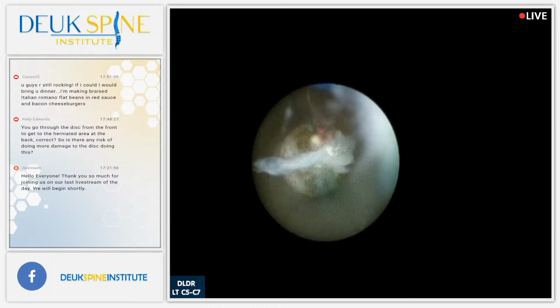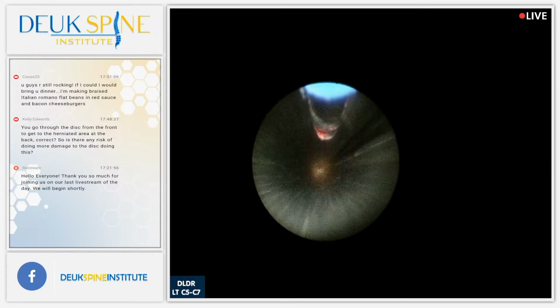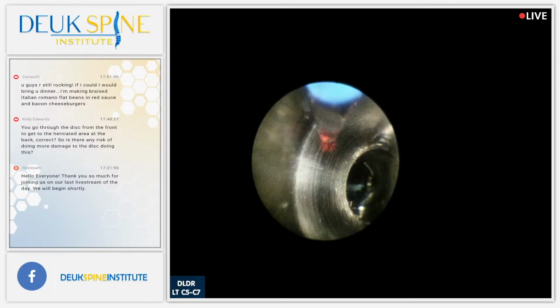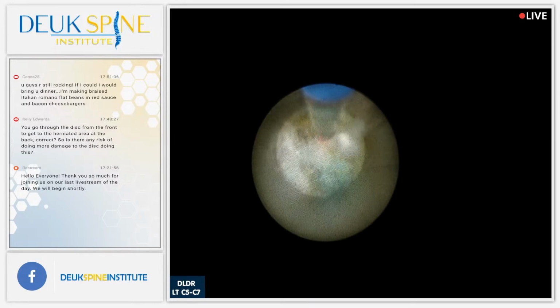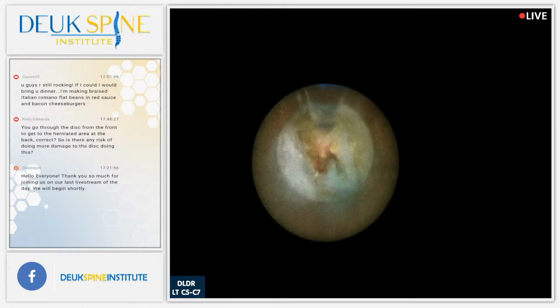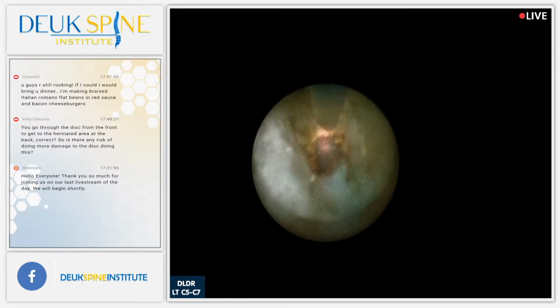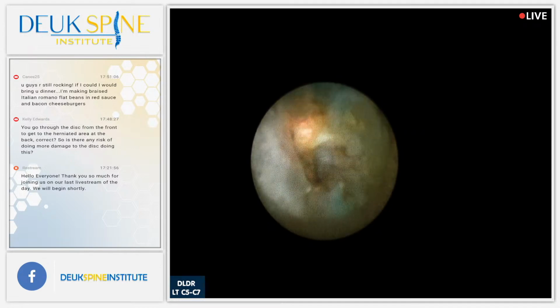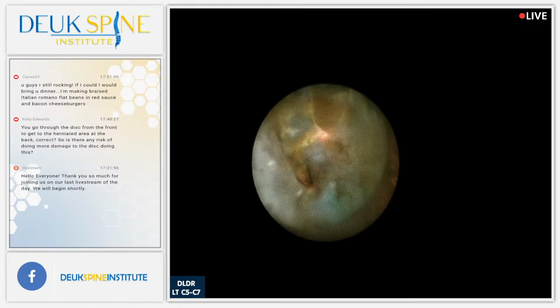So these herniations are actually further deep than we are, and they're pushing on the nerves and spinal cord. So once we remove enough of the scar tissue with the laser, they just pop out right in front of us. They come out of where they were herniated, and we call it a reverse herniation when they herniate back to where we are. That's actually a good herniation, a backwards herniation.